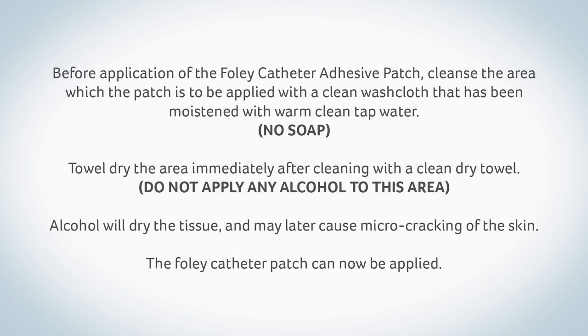Do not apply any alcohol to this area. Alcohol will dry the tissue and may later cause microcracking of the skin. The Foley catheter patch can now be applied.